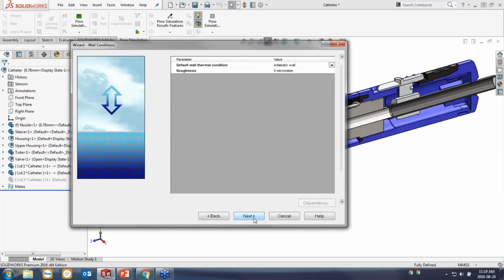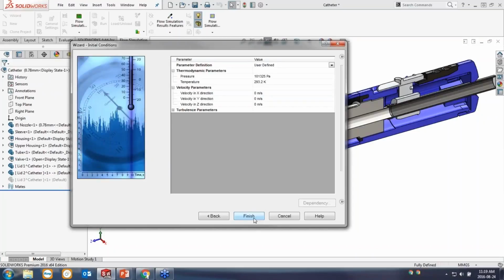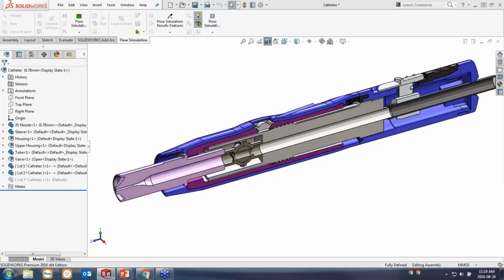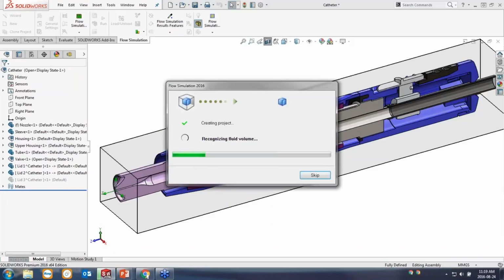I don't think for a medical device that's something we're going to get into. I'm going to accept my default wall conditions for the roughness. Assume we have nice smooth walls on the interior of our device. We've designed it that way. And I'll take my regular atmospheric pressure and temperature as my default conditions. And so that's it. We've stepped through the wizard and we've determined all of the initial conditions that we need other than our boundary conditions.